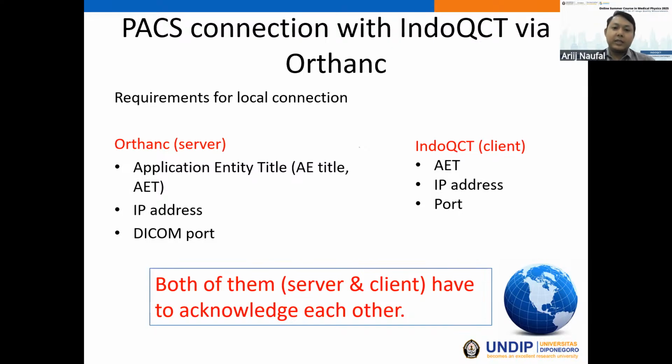So this is the default requirement for local connection. This is for Orthanc as a server, and this is IndoQCT as a client. Basically, both need an application entity title, or AE title, and both of them need an IP address, which in this case, localhost, is 127.0.0.1. We will show you later.